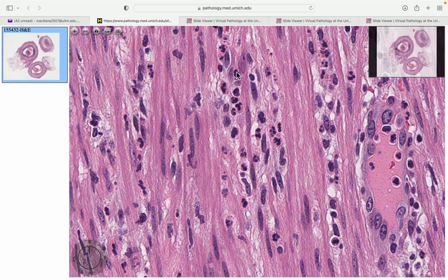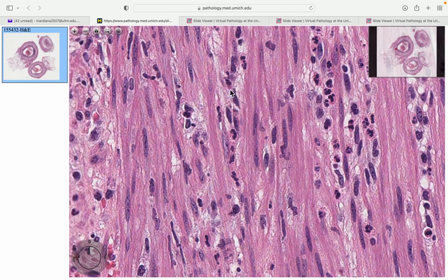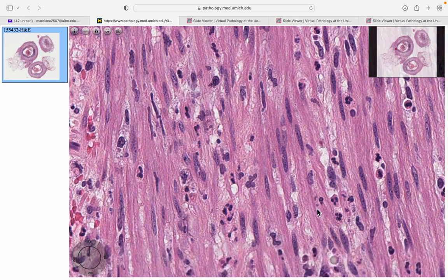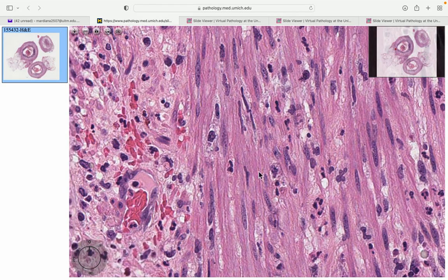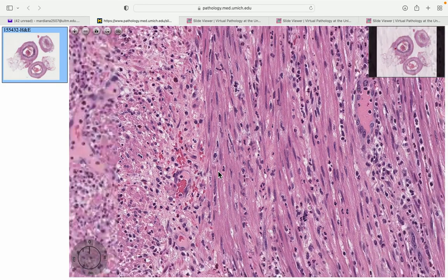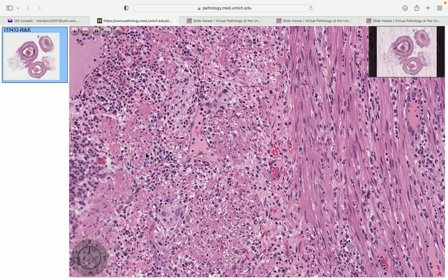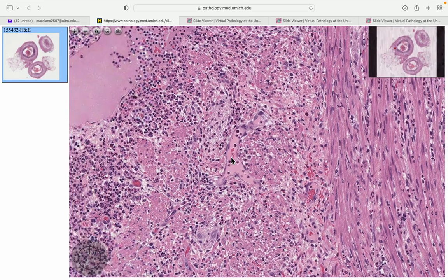If you move along and around the appendix, you will see there are actually quite a few of them scattered about. Head, two ears. All these Mickey Mouse structures are your neutrophils. That is the first thing you need to identify. They have spilled all the way into the muscular layer and into the fat.